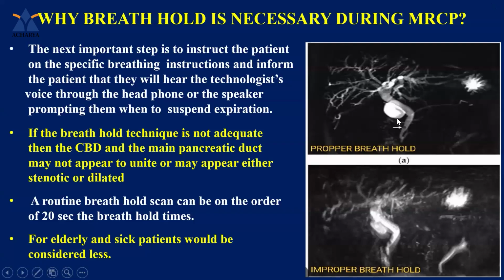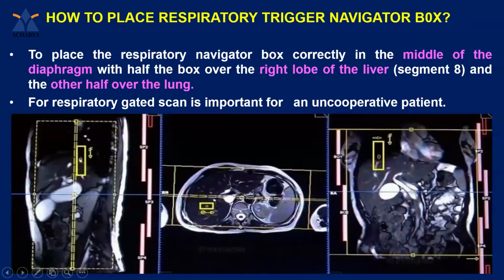So before doing the MRI scans, before these breath hold sequences, you have to give the patient practice so many times. This is very useful for the upcoming protocols.